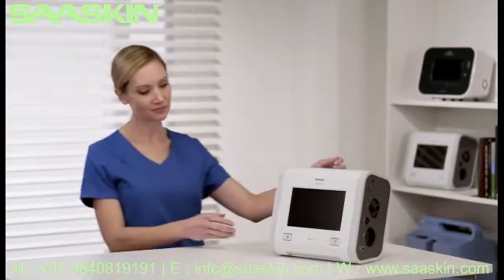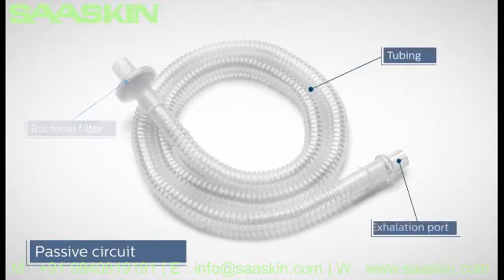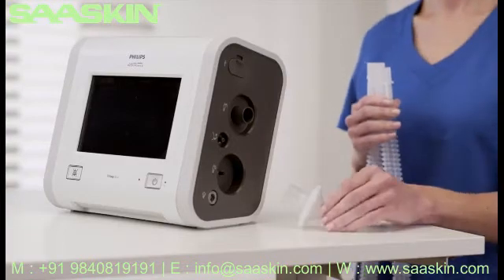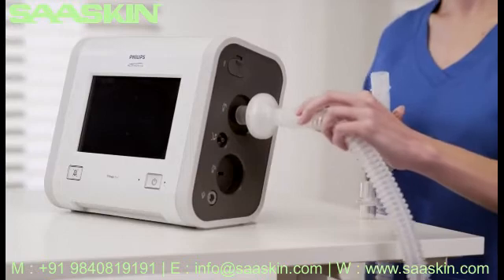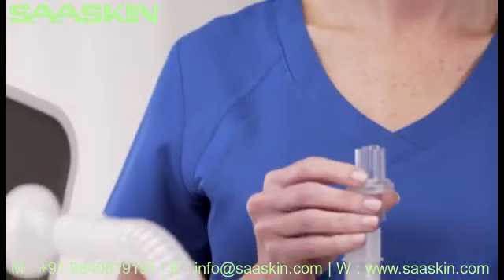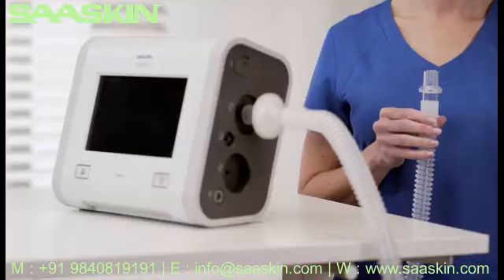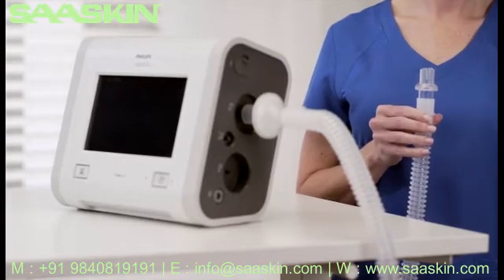The passive circuit consists of a bacterial filter, tubing, and exhalation port. Connect the bacterial filter and tubing to the inspiratory port on the side of the device. A leak device, also known as an exhalation port, is mandatory during invasive ventilation or when using a circuit with a non-vented mask. The passive circuit is now complete.